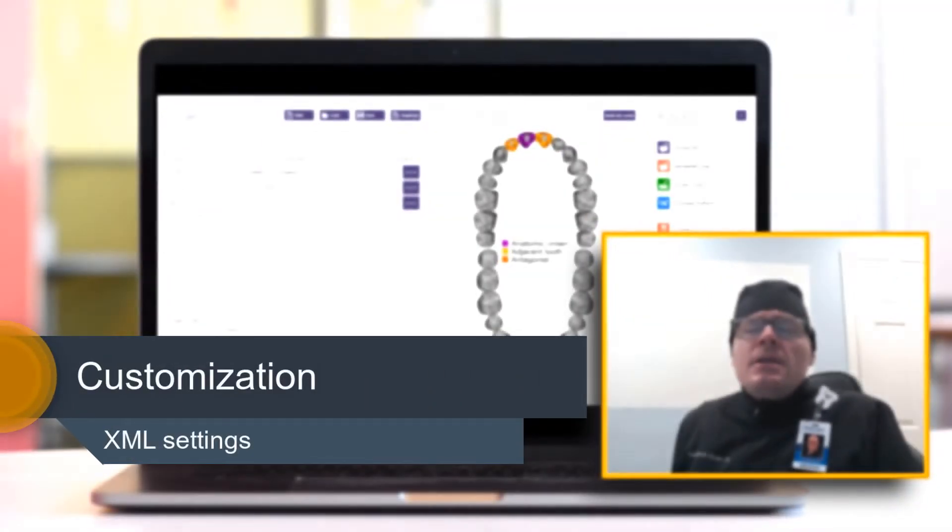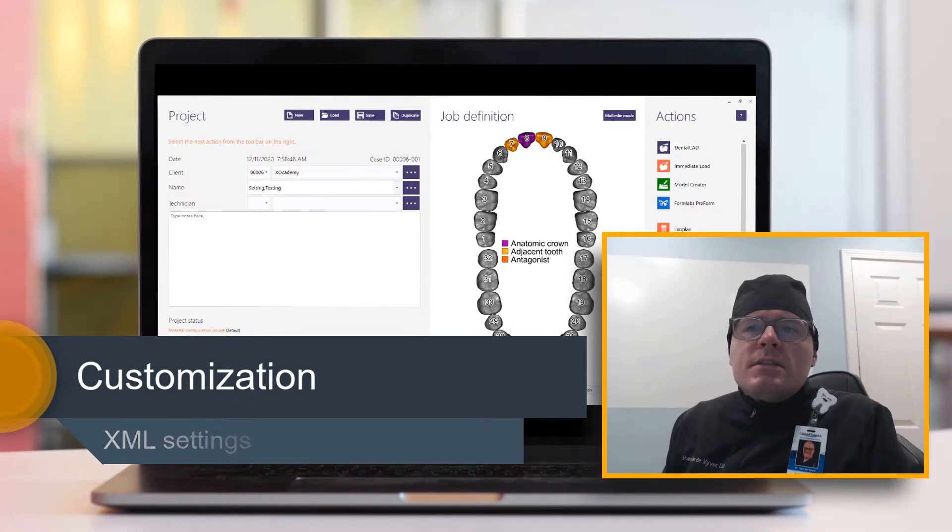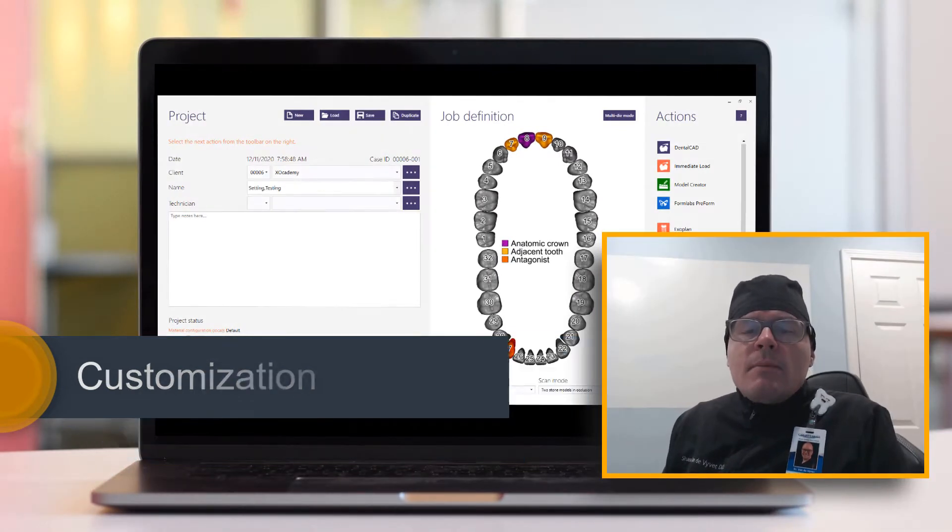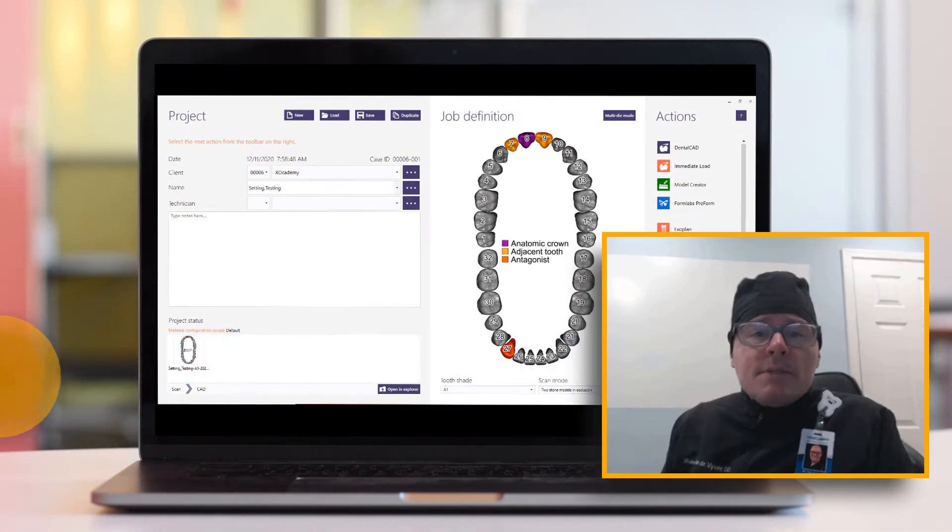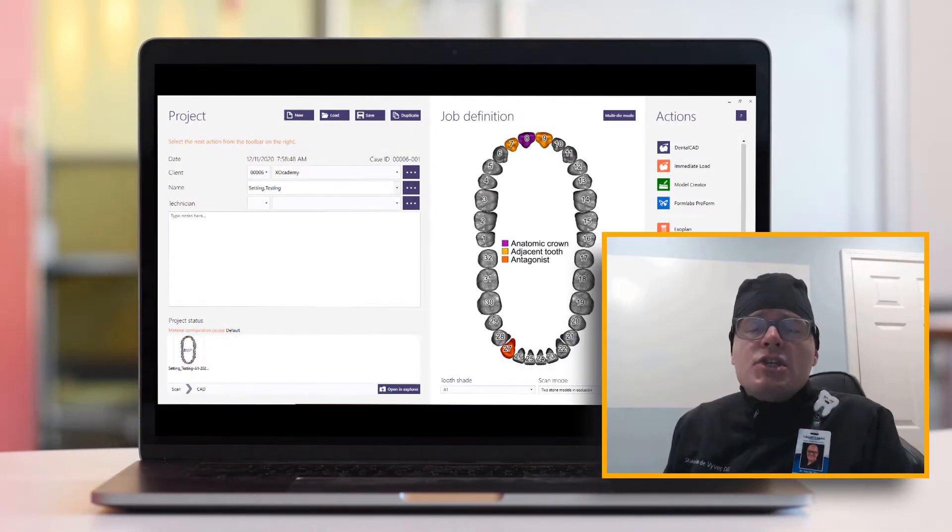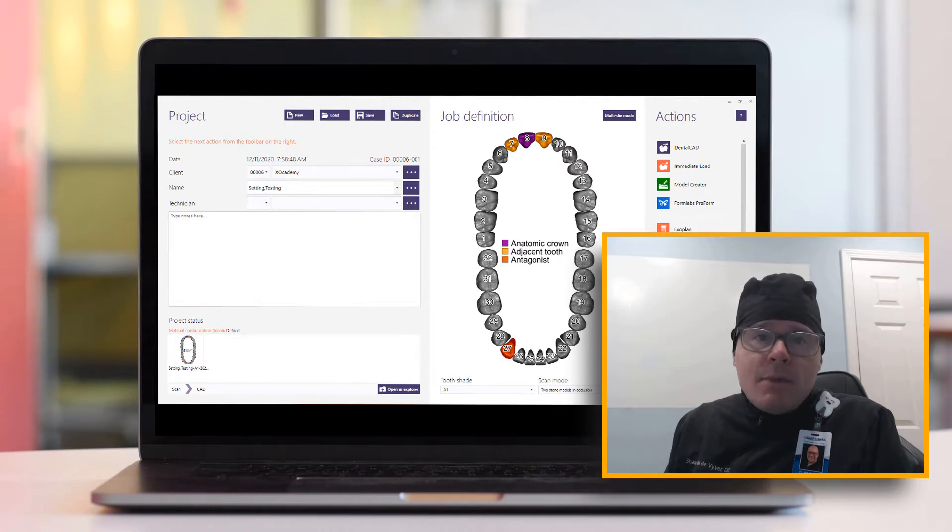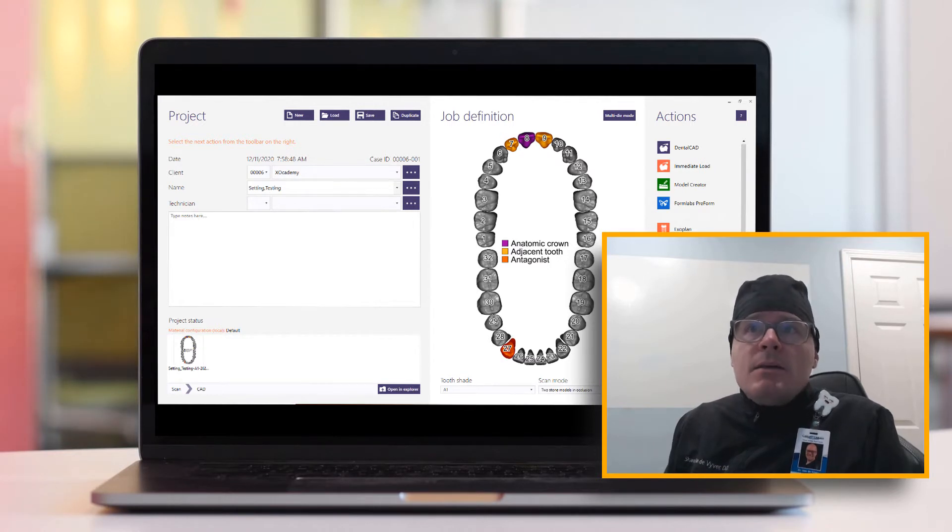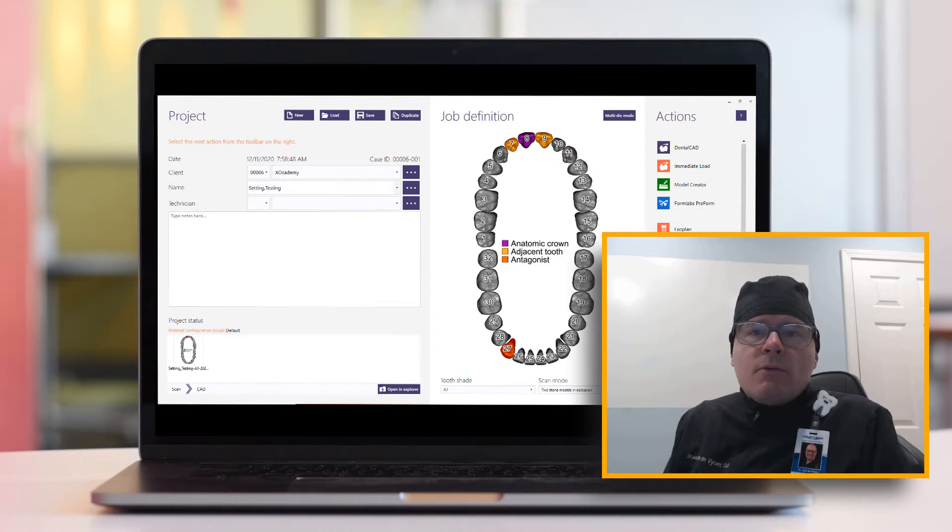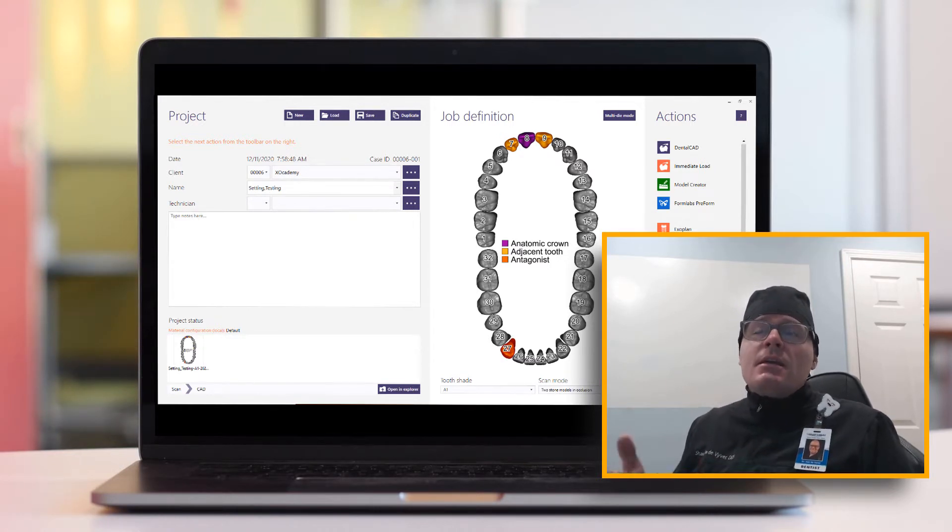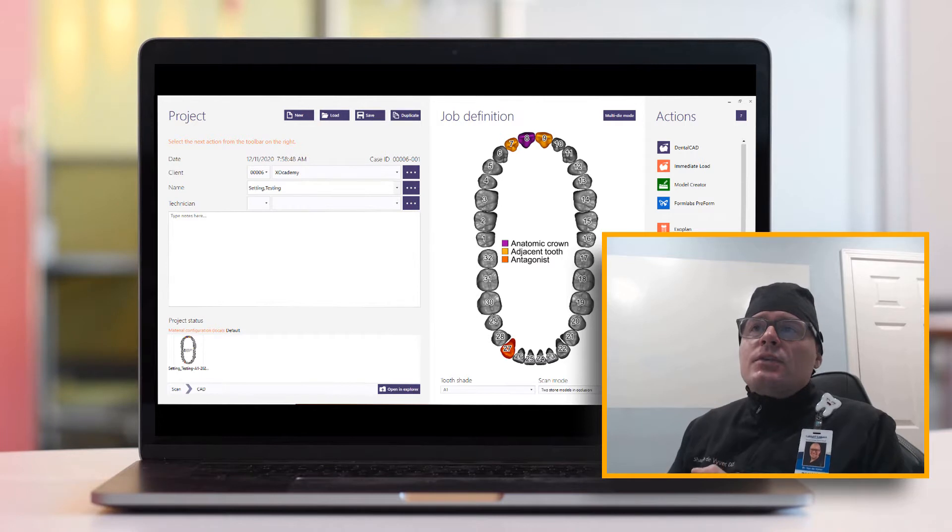Hello, ExoCADemy. In this video, I'm going to show you a couple settings that you can change in your XML file to make things more convenient for you when you're designing in DentalCAD.